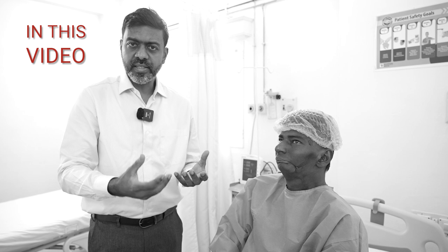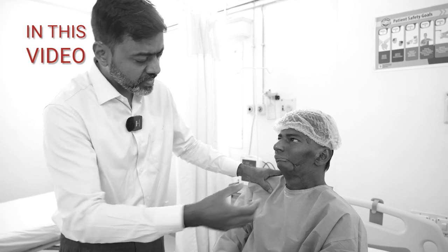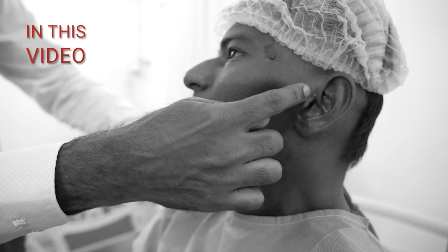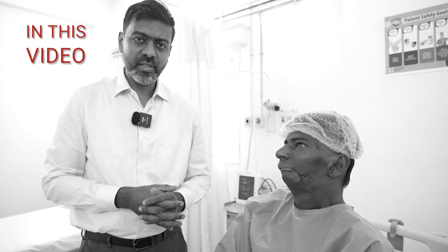So what we've planned is a 3D reconstructed implant, which is going to host a tibia or a fibula flap. That means bone from the leg is going to come here with a prosthesis that's going to sit here, like a knee replacement. We're going to have a temporomandibular joint replacement. That's the plan. We've got some doctors and surgeons who've come to help us out also with this case. It's a pretty challenging one, when we're thinking it's going to take about 7 to 8 hours.